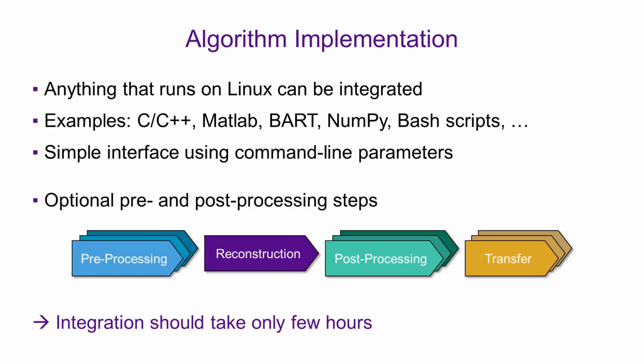And Yarra is very flexible regarding how you program and implement your algorithms. Basically, anything that runs on Linux can be integrated, which means that you can program your algorithms in any language like C++, MATLAB, or Python, or you can even write something just using bash scripts. And all of that can be integrated into Yarra. And there's a very simple command line interface to do that. So it should really only take a few hours to integrate your algorithm into Yarra, and then it's available from all your MRI scanners. And it's also possible to add pre- and post-processing modules, so you can also integrate basic image analysis functions.